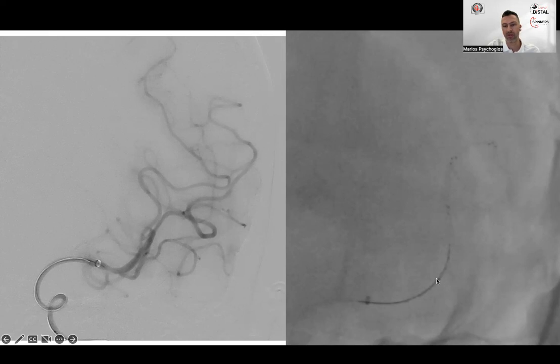And what we will do now is exchange this microcatheter for a smaller aspiration catheter, a 3 French aspiration catheter. Usually in this talk, as you will see, I'm not talking about material specifics, because if there are multiple microcatheters, you can use multiple. One thing that I found is that the Headway Duo, the long Headway Duo, is really helpful for M3 occlusions.